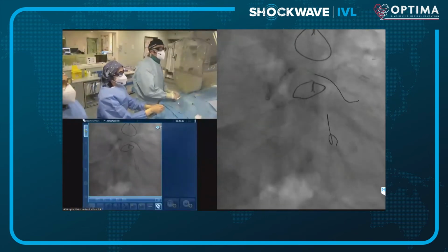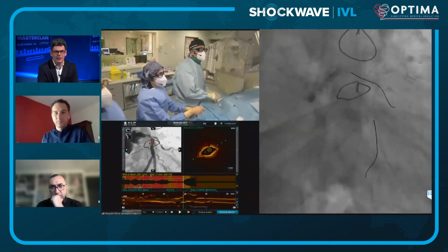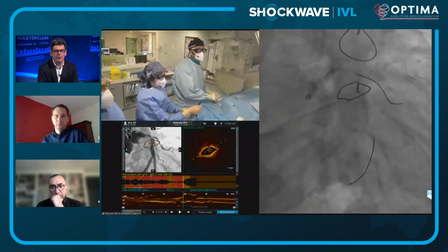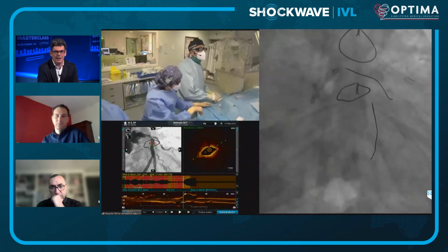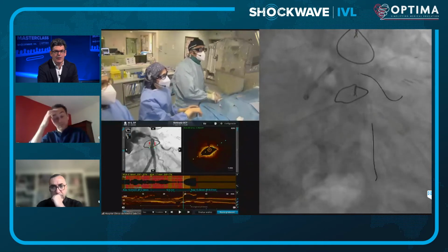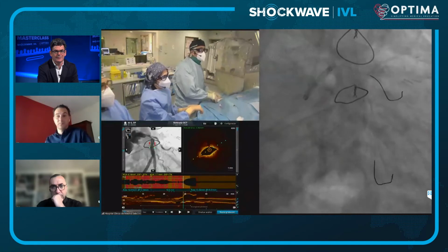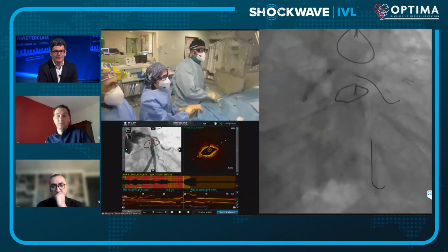So you've got a wire in the, there's a marginal vessel there, is there? And then you've got flush occlusion of the LAD here. No, sorry, I see. Let me just make sure that I advance my wire beforehand because it moved a bit now. Just making sure that everything is good here.